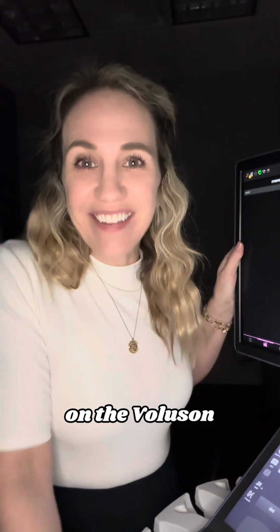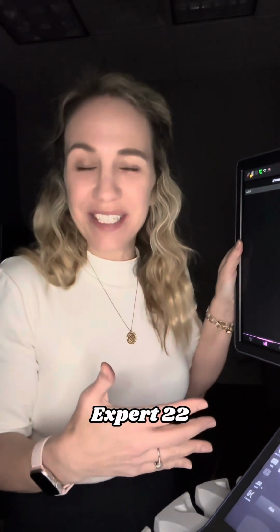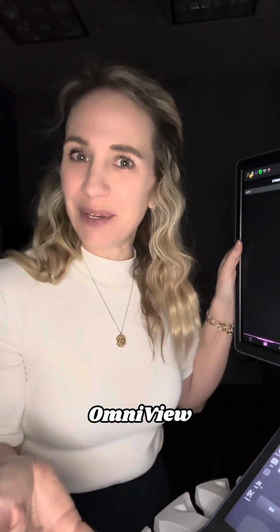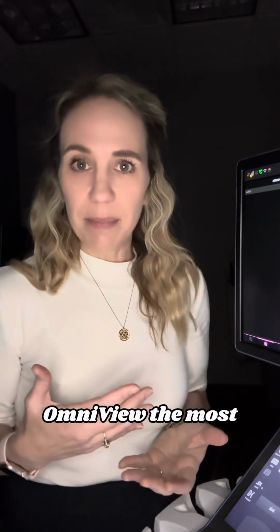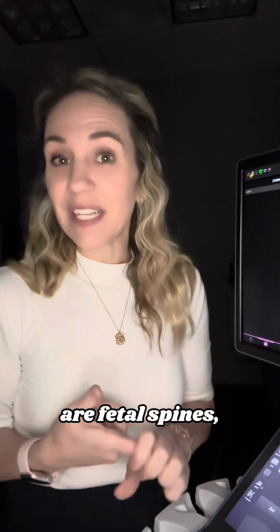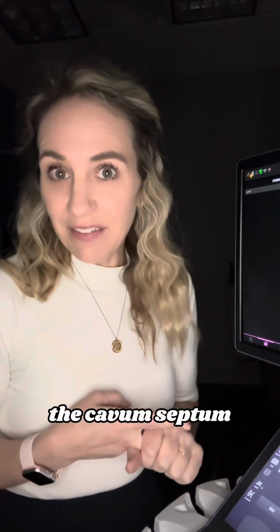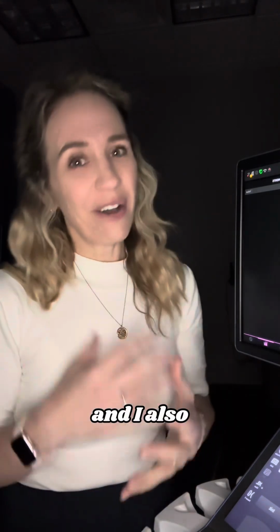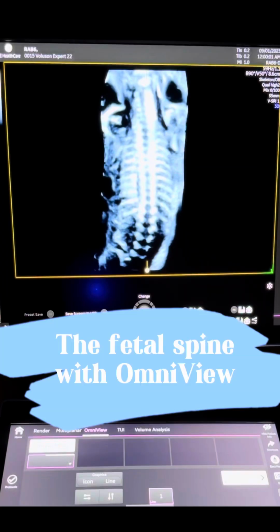Today we are on the Voluson Expert 22, and one of my favorite tools to use is OmniView. The exams that I use OmniView the most are fetal spines and the cavum septum pellucidum, the CSP, and I use that to evaluate the corpus callosum, and I also use it in my GYN scanning. Let me show you how to use it.